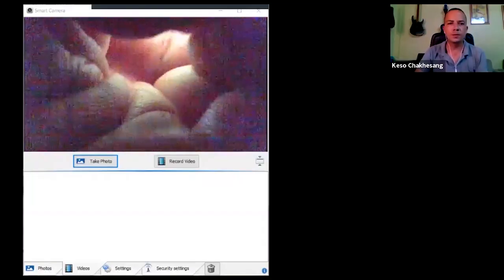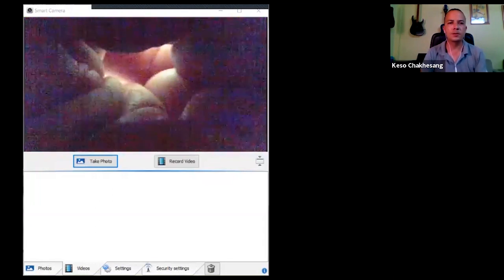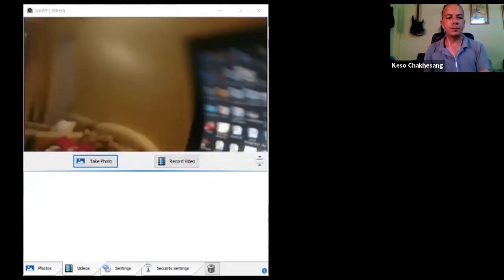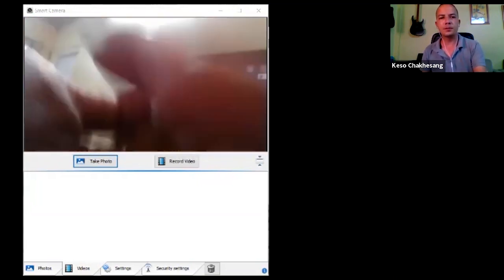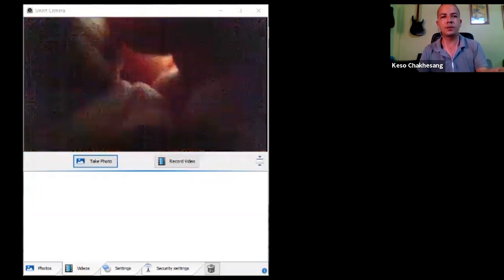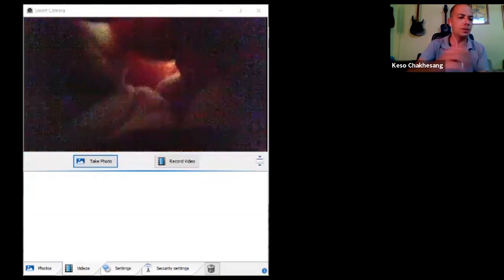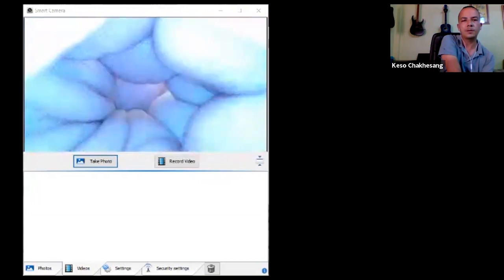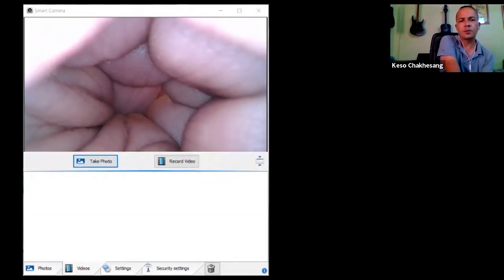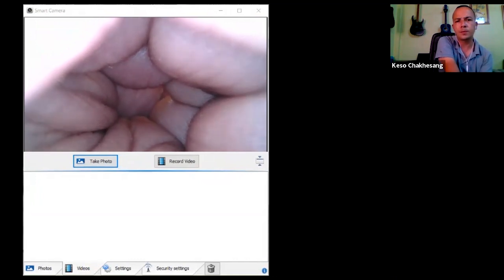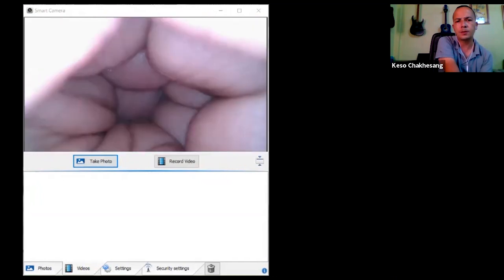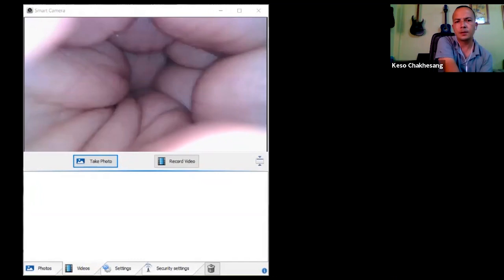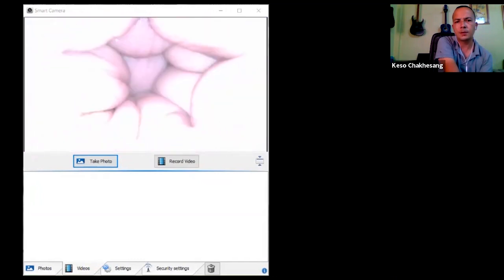If you have a very bright light very close to the tissue, then quite a lot of it is reflected. You won't see very clear pictures. So you need to reduce the light when you go closer. So what you can see now is the feed from the scope. I'm just going to put it inside my hand. The lights are off now. I'm just going to increase the light to maybe about 50%. So the lower the light, the more you'll have a grainy footage, a grainy video. So you need to find the right balance. Now I'm increasing it. This is at about 100%, and I'll just reduce it to maybe about 80%.